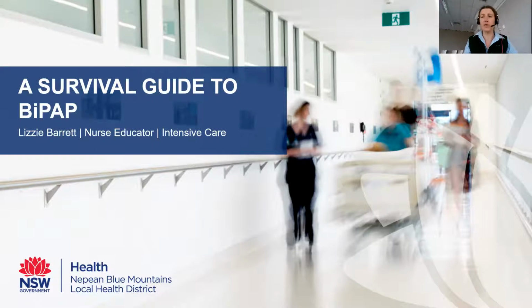Again, this is designed for patients in an acute setting with an acute respiratory failure issue. This is in no way to be taken in the context of chronic patients requiring chronic long-term non-invasive ventilation.